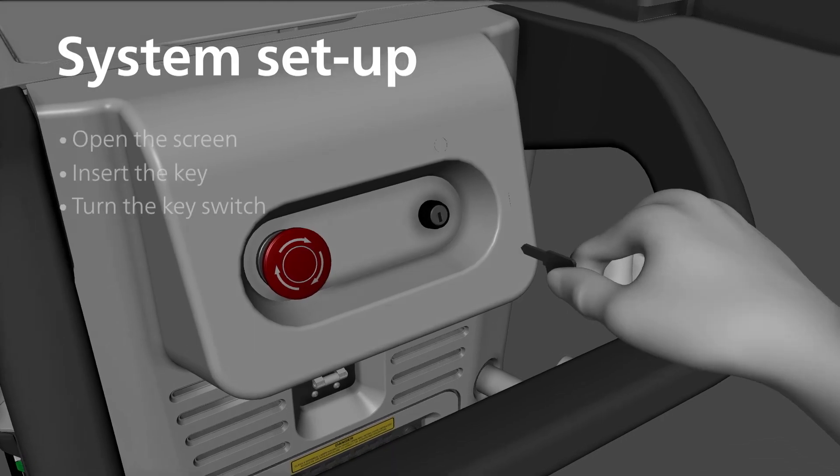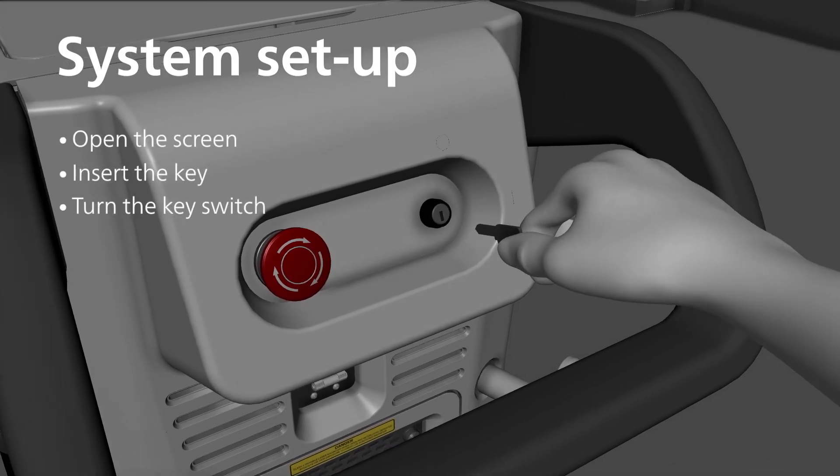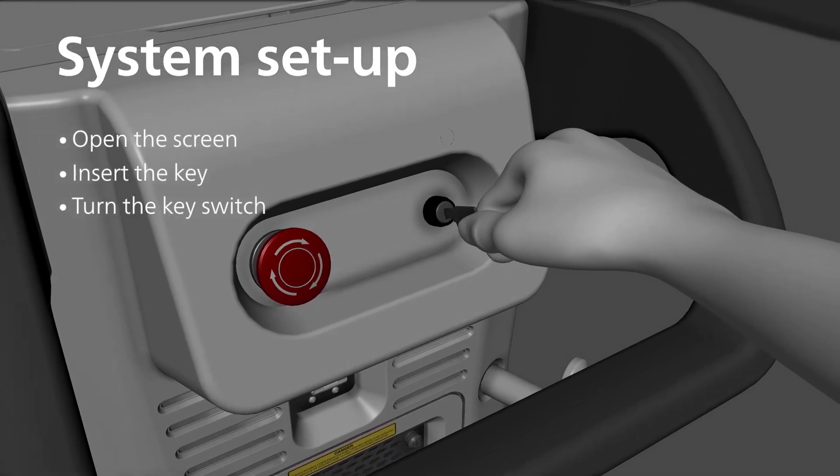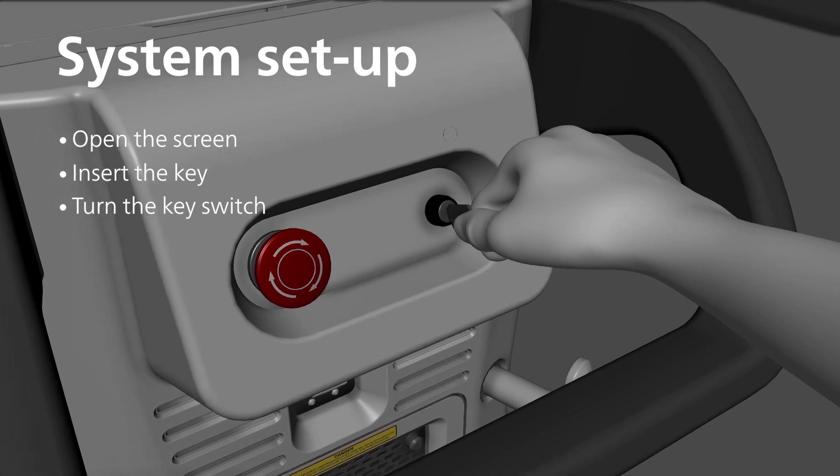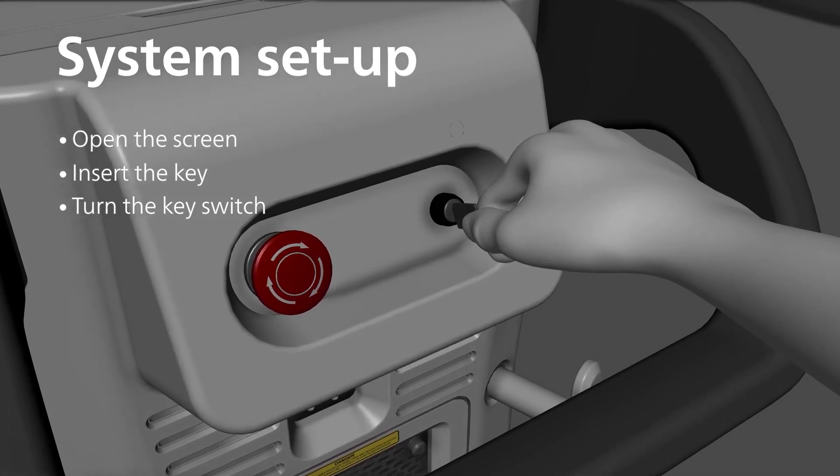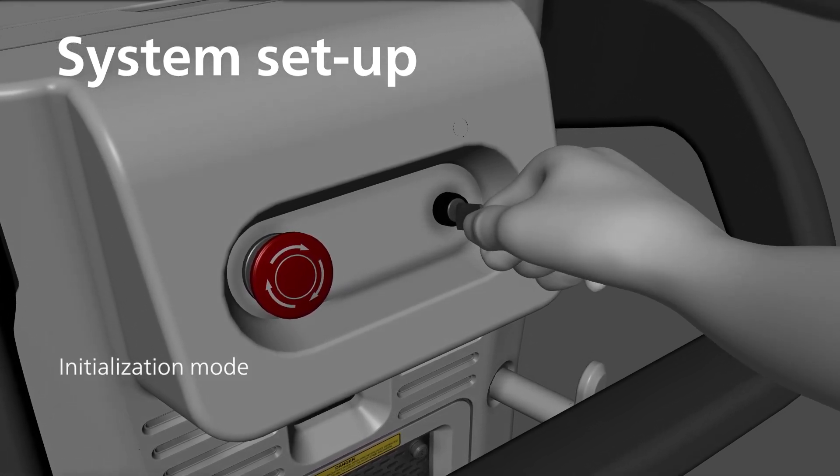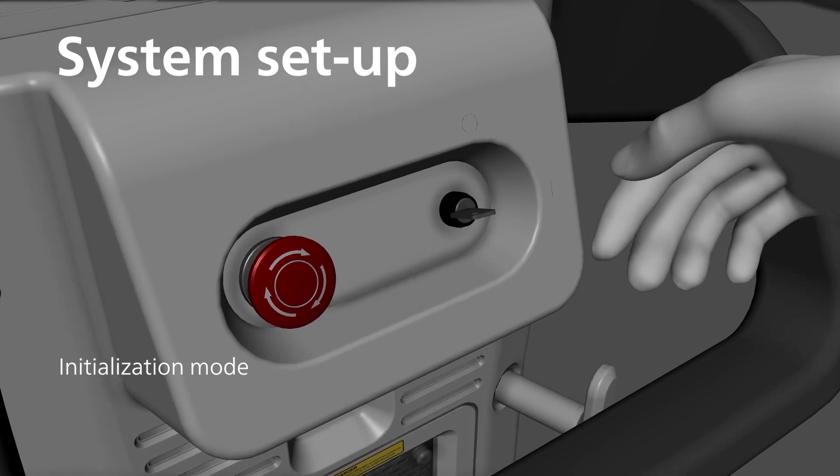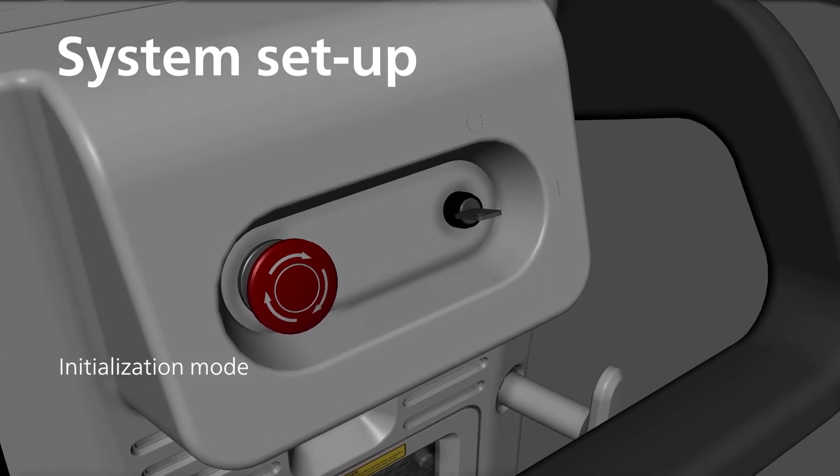Insert the key into the key switch on the rear panel. Turn the key switch clockwise to activate the system. When the system is activated, it enters initialization mode.